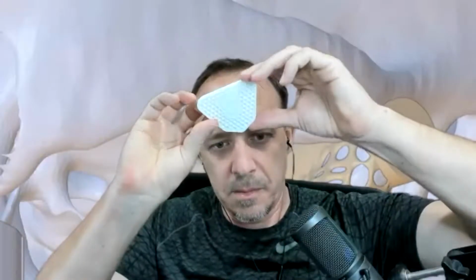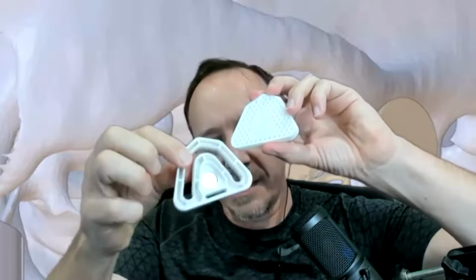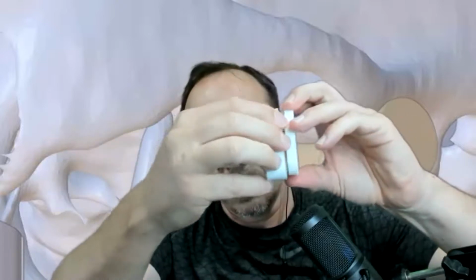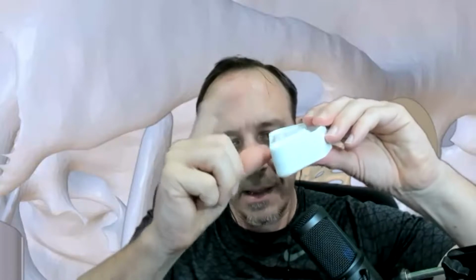Don't you have it next to you, the two that snap together? Oh yeah, I've got them here. Yeah, that's what I'm talking about, Wolf. Okay, so can you see it? Yeah. So that one is going to go onto an articulator with stone, with plaster. Yeah, that's correct. And then this one will have the magnet sitting in it. Magnet. And then these two will just clip into position. And the wedge here will allow for a future hinge articulator, if you want to use a hinge like that.